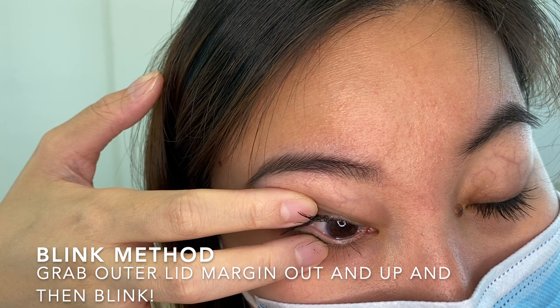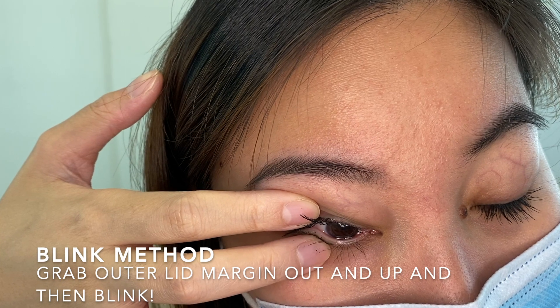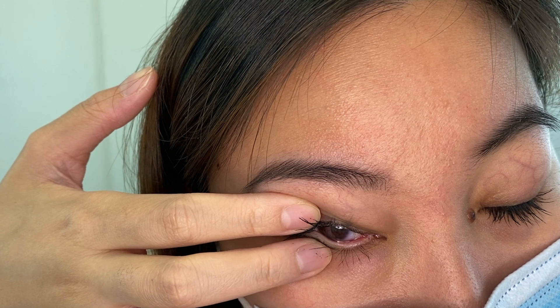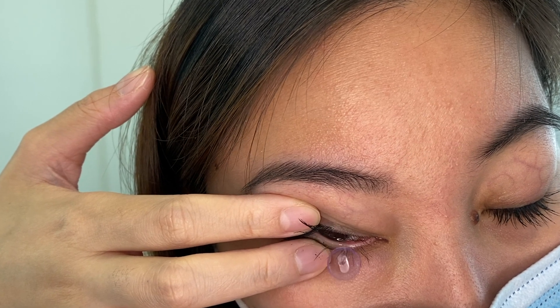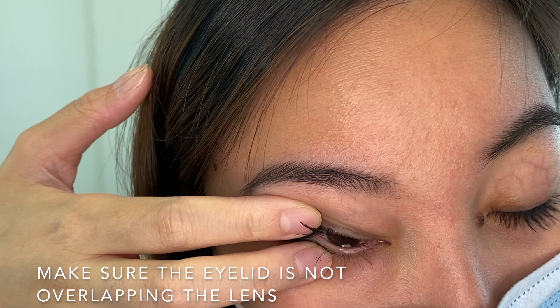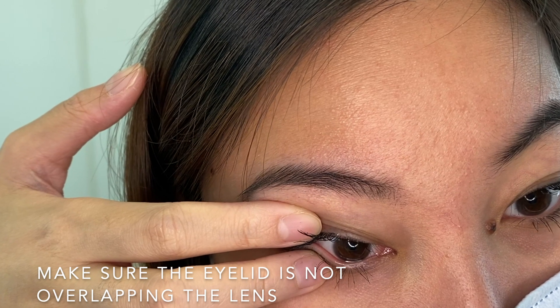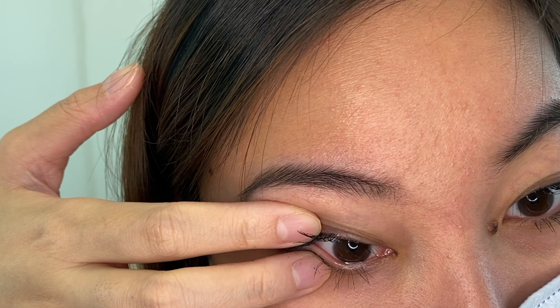The last method is called the blinking method. All you need to do is pull the outer lid margin tight and firm sideways and then blink. You need to make sure that the eyelid is not overlapping the lens. If you pull the lower lid tight but it's still sitting on top of the lens, it will prevent the lens from popping out.